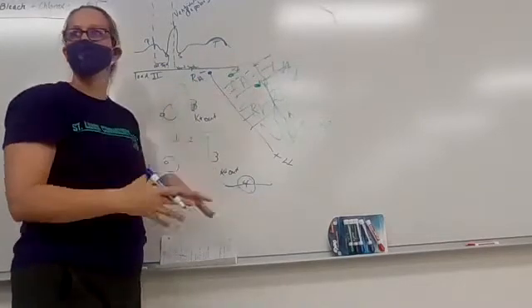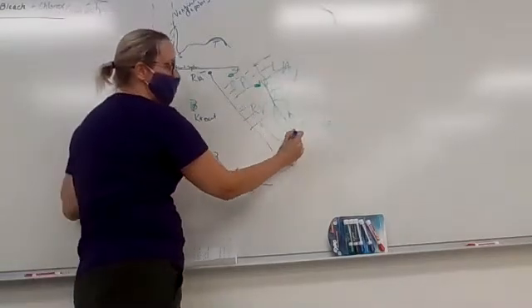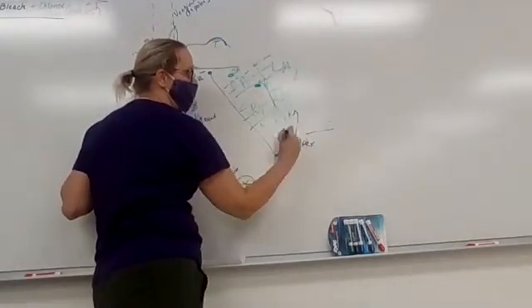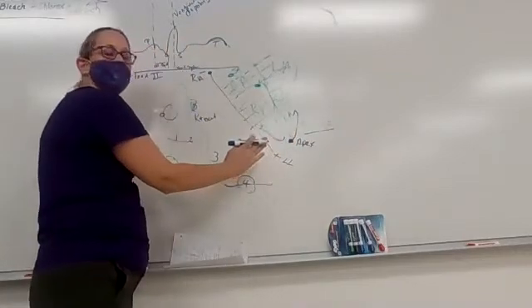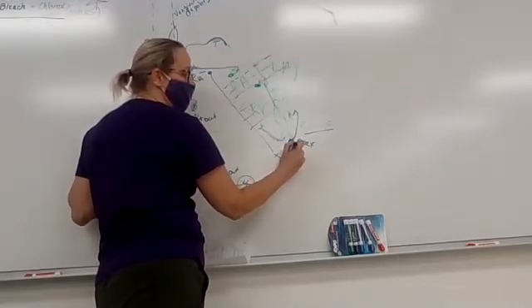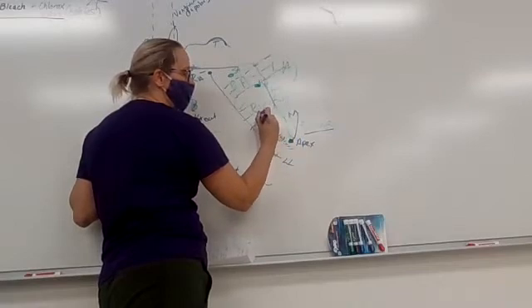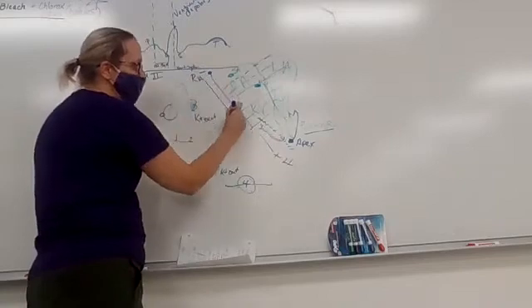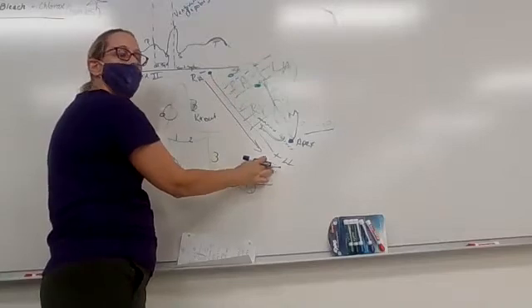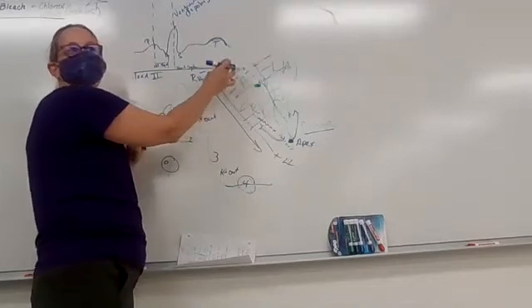And it has to do with physics and vectors. Okay, remember, when we ask the heart to depolarize, we ask it to get to the apex and depolarize with those Purkinje fibers outward. So when we are getting cells to start repolarizing, the cells that are going to start to become negative again are going to be down here, and the cells that are still depolarized are up here. I measure things in a negative to positive direction on lead 2 from right arm to left leg. I repolarize from left leg towards right arm.